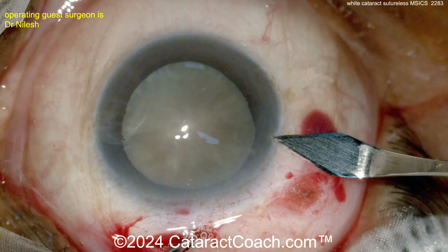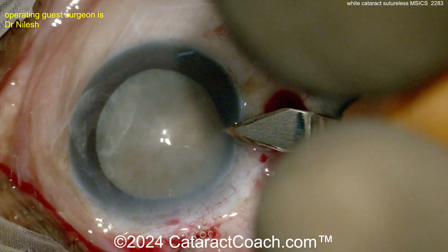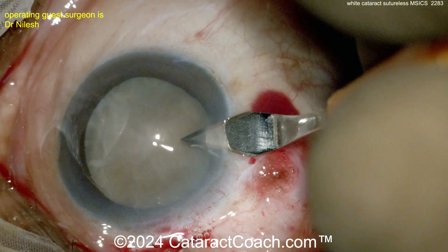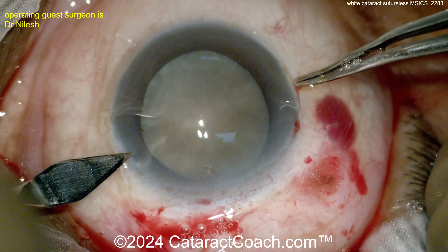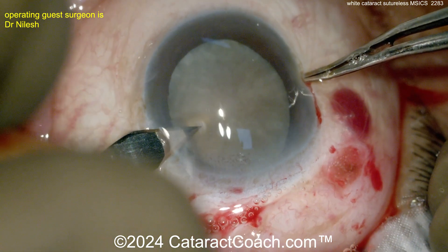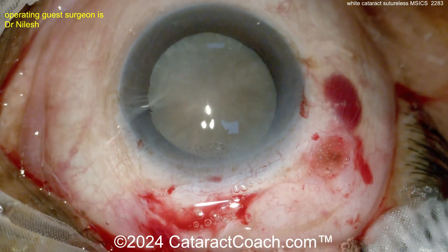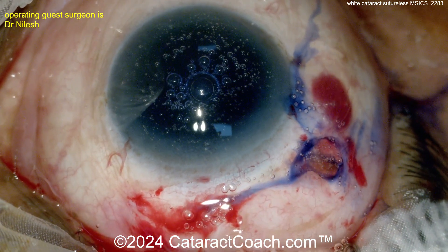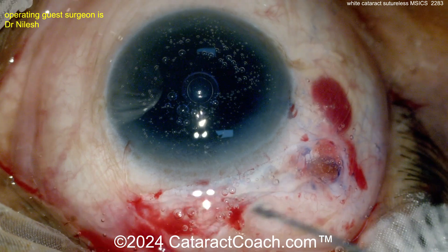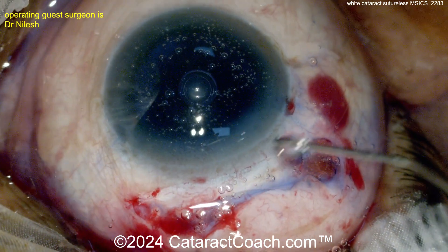Using the keratome for a side port — and there you go. Oftentimes surgeons in this situation won't even use a phaco machine. There's a Simcoe cannula, which is what they'll use to remove cortex. So here we have two side port incisions, and now trypan blue dye going inside the eye, followed by probably anesthetic or BSS.